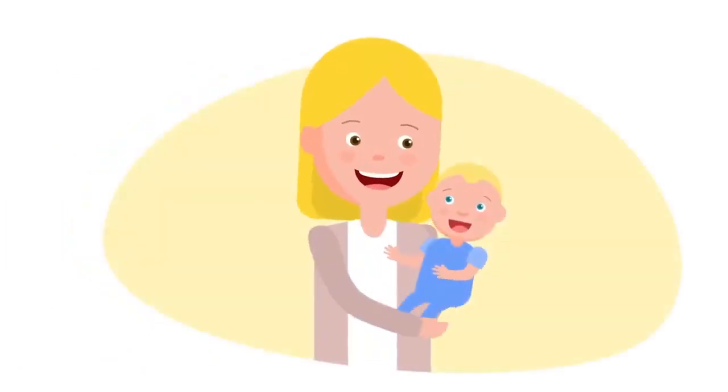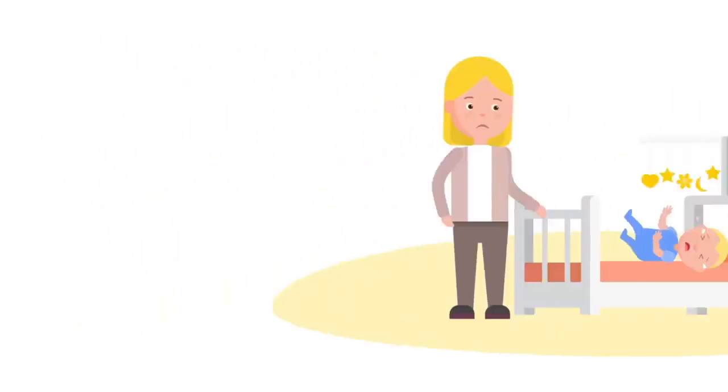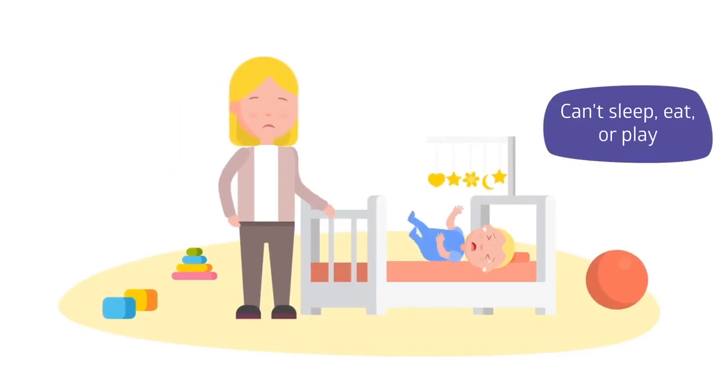Did you know that babies can't blow their noses? When a baby has a blocked nose, they can have trouble breathing. They can't easily sleep and eat or have fun playing.